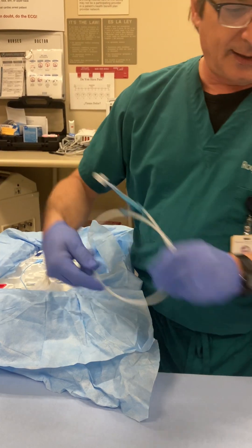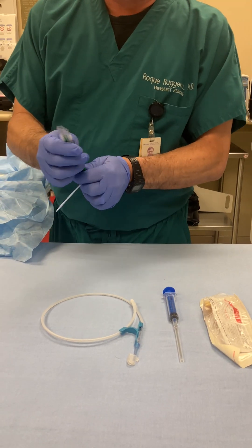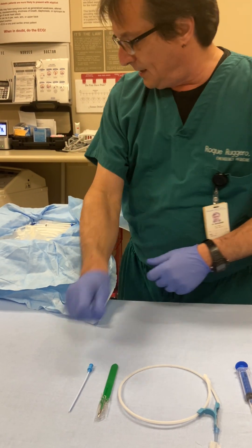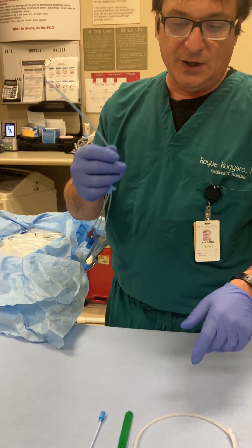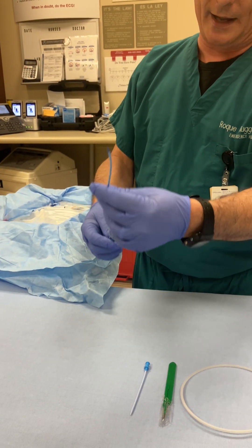I will then advance the guide wire. I'll then make a nick in the skin — the triangular-shaped scalpels are number 11 scalpels. I'll advance the dilator. After the dilator has created a track for the catheter to go through, I'll remove the dilator, the wire is still in place, and I'll thread the catheter over the wire.